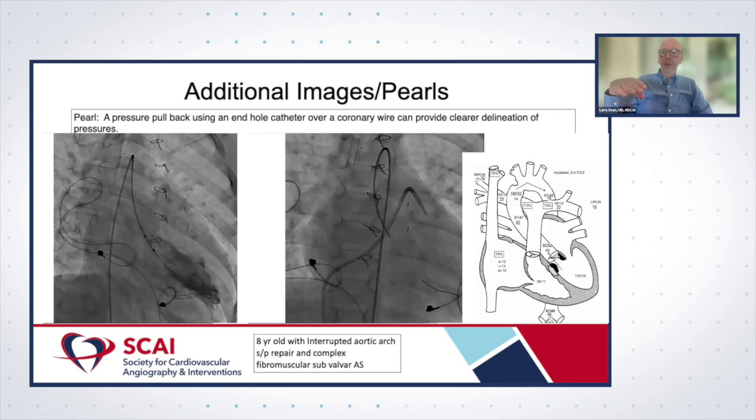using that guide wire or pressure wire really allows very precise location of the abnormality. Even if you're dealing with somebody with hypertrophic cardiomyopathy, we don't do that much anymore because echo usually tells us what's going on. But nonetheless, pulling back very slowly with a catheter that has a single end hole in it and no side holes or one or two side holes that are very focal gives you a lot better ability to pick up something like this. Is very focal. Again, it would have been very interesting to see how it would have turned out with this particular subaortic membrane being very flexible. I'm not sure what would have happened, but it would have been interesting to look at that.